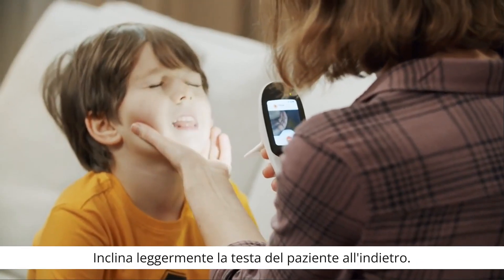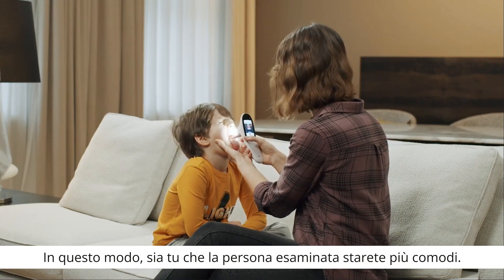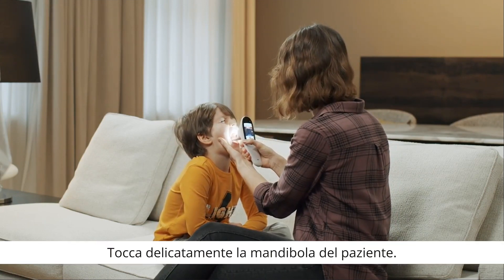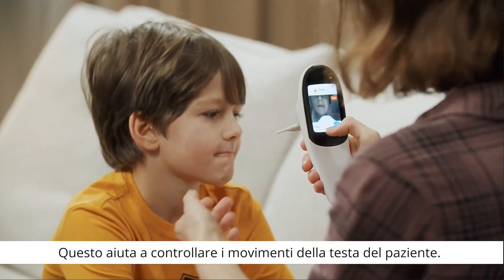Gently tilt the patient's head slightly back — this way you and the test subject will be more comfortable. Place one hand on the patient's lower jaw; this helps you control the patient's head movements.